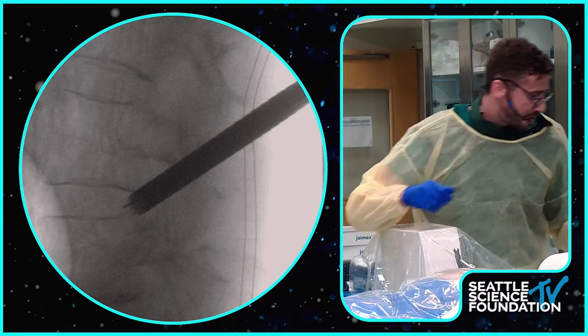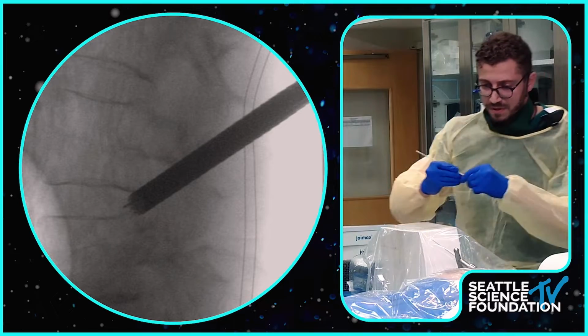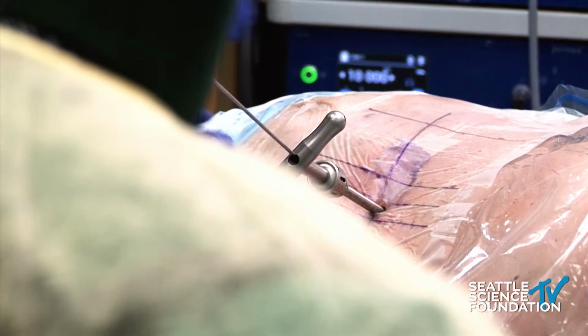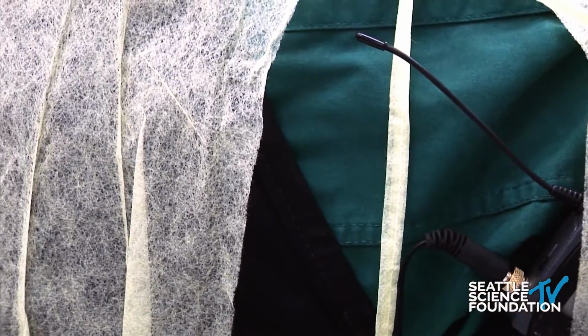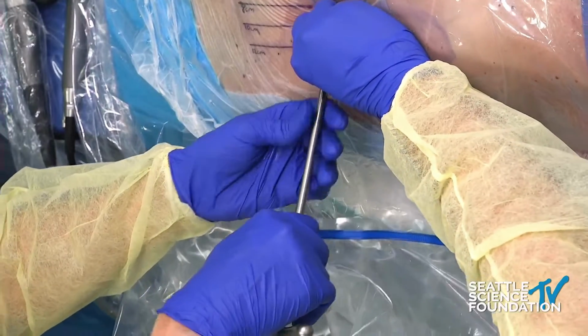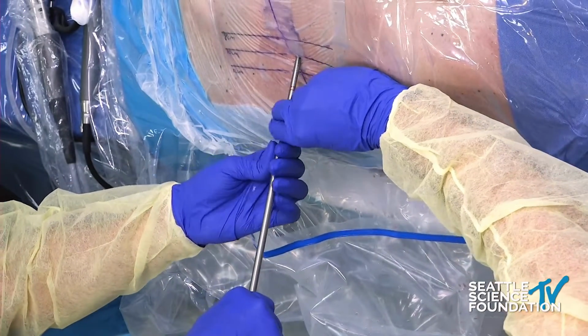I'm going to take, can I have the pusher, please? We put the pusher in here just to not have everything pull out. Thanks a lot, Lynn. This is just to hold things in, because sometimes when you pull the reamer out, it pulls everything else out with it. So here, Dr. McGrath is going to hold the things in. Okay, perfect. This gives me a nightmare from the endovascular suites. Absolutely, yeah, it just adds a lot of time when things get pulled out.